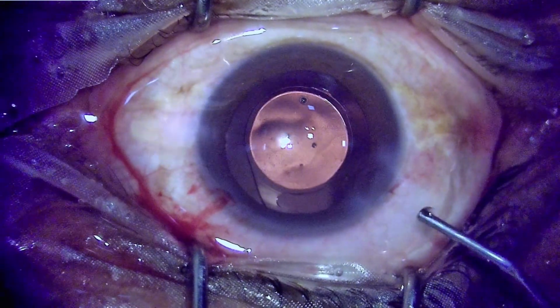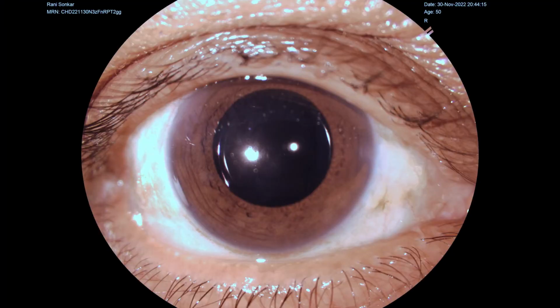This is the day 1 post-op picture where you can appreciate the pupil is dilated, the IOL is well centered, and most importantly the cornea is absolutely clear.